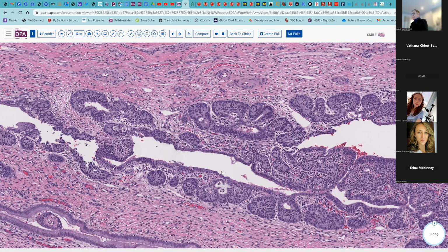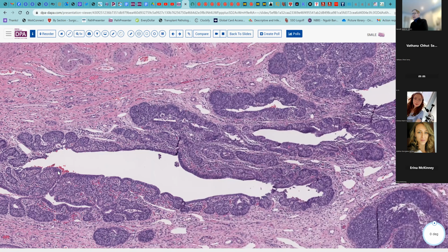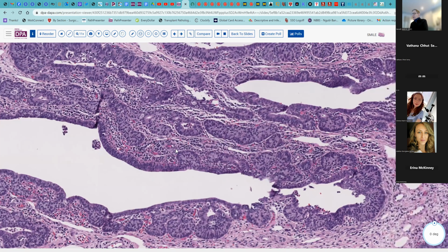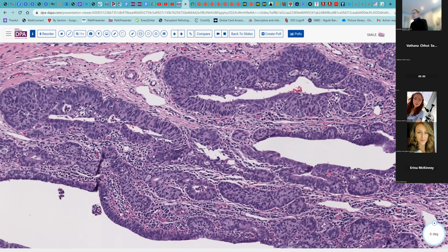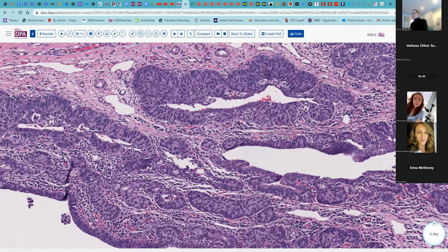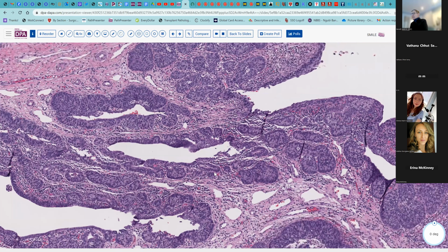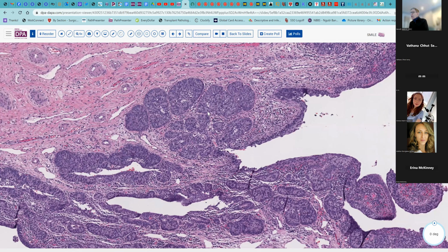And we'll go up here to the surface. And here we're seeing, again, this combination of sort of basal mucinous epithelium proliferation, atypia, and some almost squamous-like features. So it's really hard here to say, is this a glandular dysplasia or is this a squamous dysplasia? What's really going on here? And that's often the case in these lesions. They're sometimes difficult to distinguish between whether they're squamous or glandular.